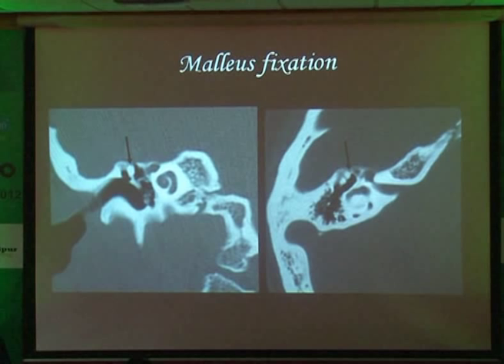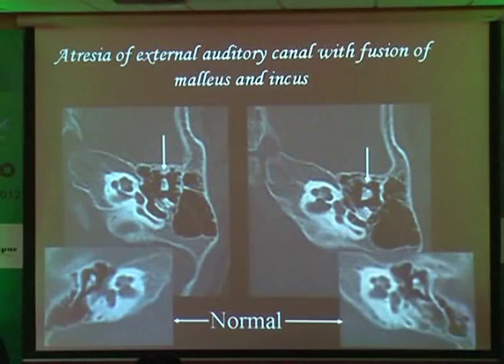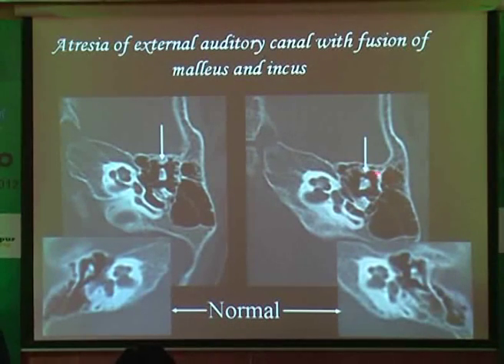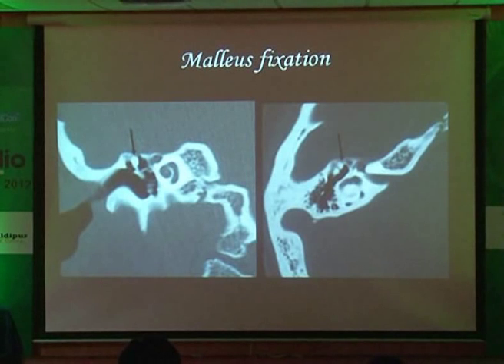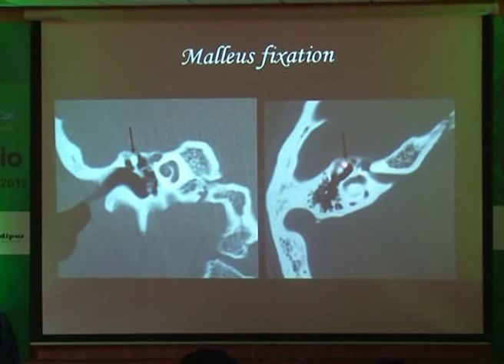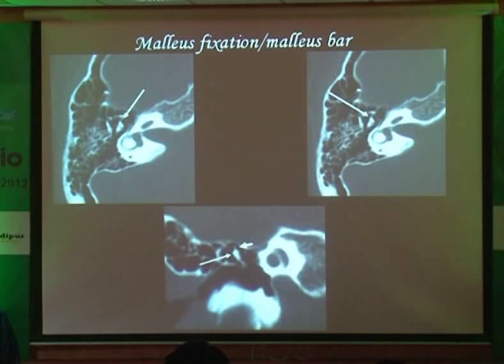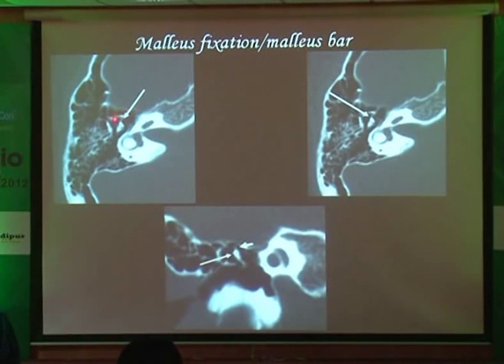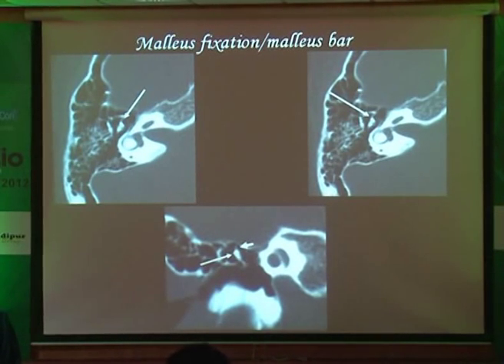Let us look at one more illustration. This is pretty rare: the fixation of the malleus, or malleal fixation — there could also be a malleal bar. You should normally see air within the epitympanic recess above the malleus. But here, the malleus has moved up and become fixed to the epitympanum — this is malleal fixation. You also see a small calcification going out from the malleus: this is a malleus bar, again causing fixation to the epitympanum. Classical ice cream cone appearance is present, but a small osseous bar is fixing the malleus onto the epitympanum.